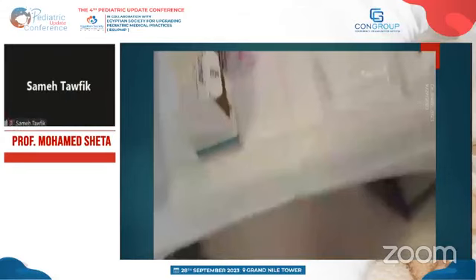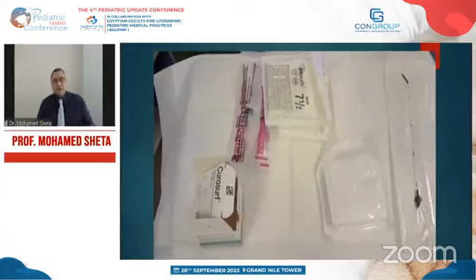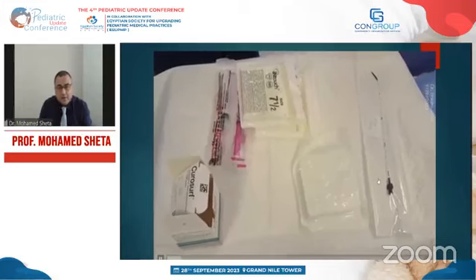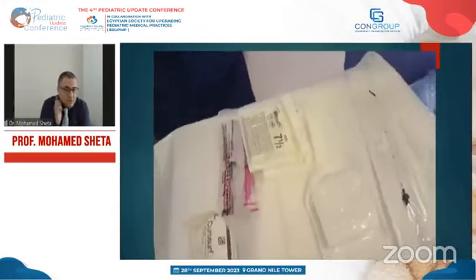I would like to show you this video, and this is a video of preparation for surfactant administration. Do you hear the voice? Yes, it's okay. So this is a video for preparation. This is the syringes, and this is the Sorvacath. I don't know if you can hear the voice in the video.